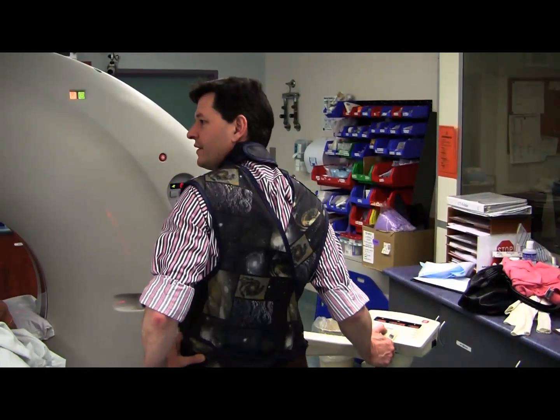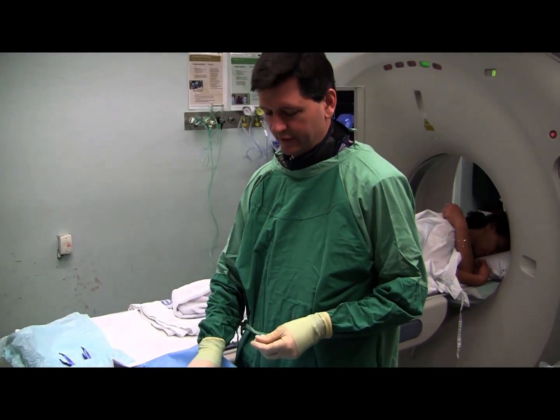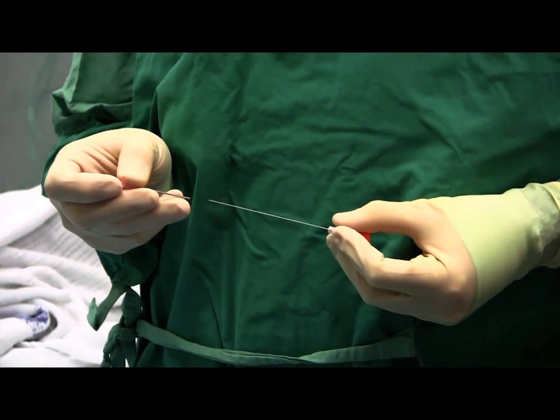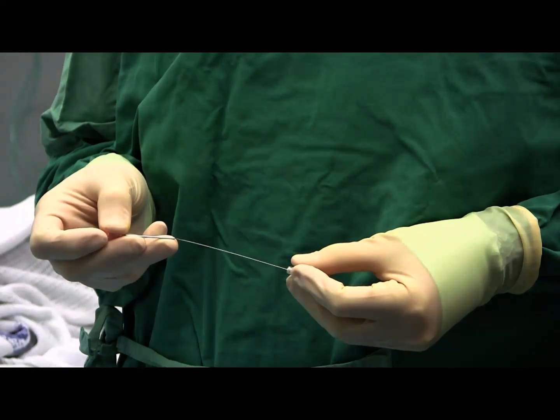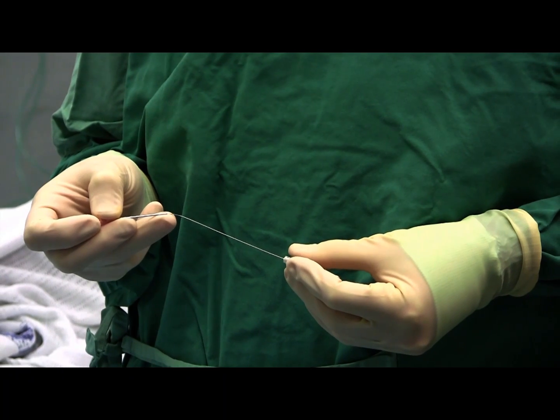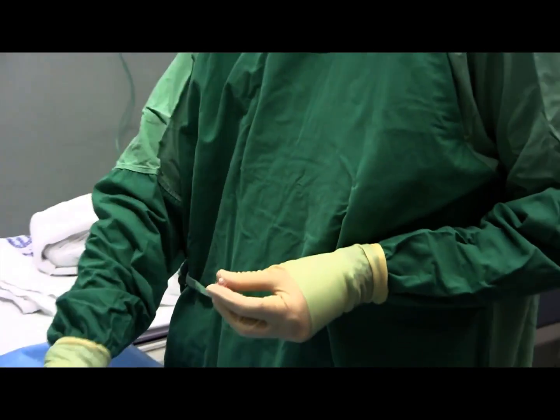We're just having a bit of a think about the best approach to get to the intervertebral foramen. You need to get to the nerve root and obviously avoid going anywhere near the vertebral artery. One of the things we do routinely for these cervical nerve root injections is put a bit of a bend on the needle. We insert the 25-gauge needle inside a 19-gauge drawing-up needle and put a bit of a bend on it. The bevel of the needle is uppermost — we know its position from the notch on the hub. That bend gives us some steer so we can get the needle tip to go exactly where we need it.